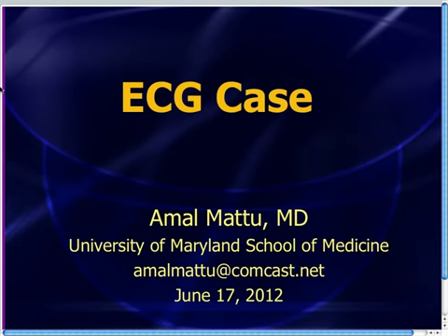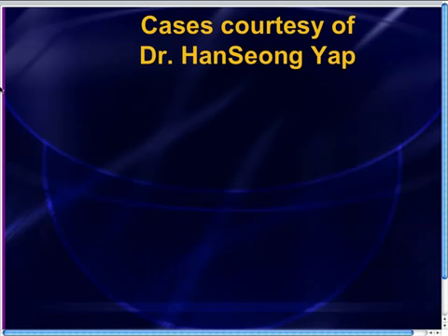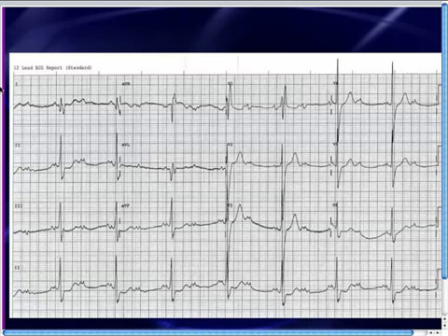And today, we've got a couple of cases that were contributed by Dr. Han Seong Yap, and I sure as heck hope I'm pronouncing that name properly. But this is a very nice physician in Malaysia who's been a regular watcher or listener of these video cases, and he's sent me some very nice cases over the past few months, and I wanted to share with you a couple of cases that he recently sent me. And these are to be considered probably bread and butter, but nevertheless very, very important cases that we can work through. Just two cases, so I don't think this will be too long of a segment.